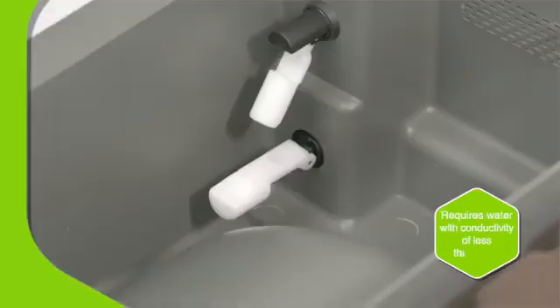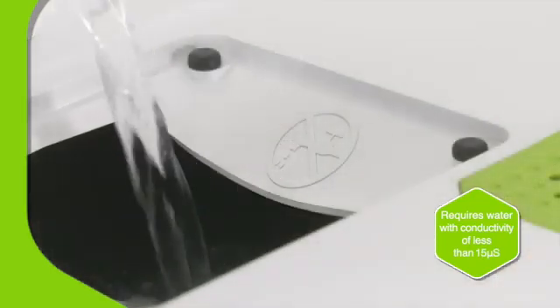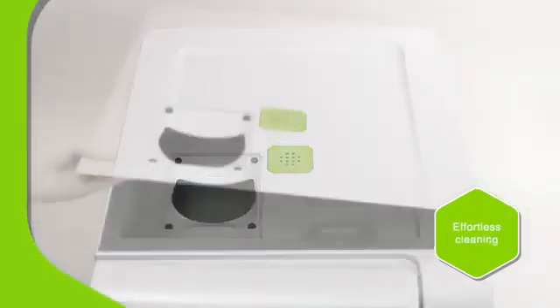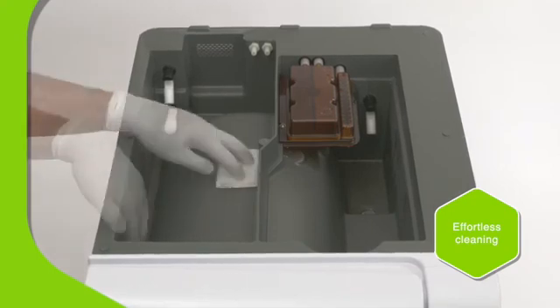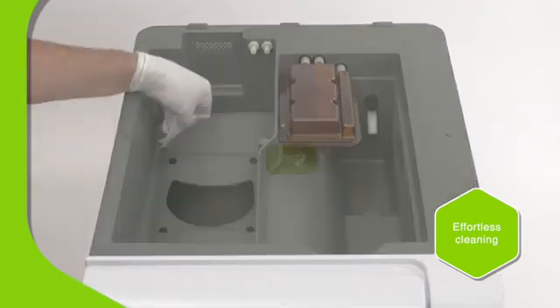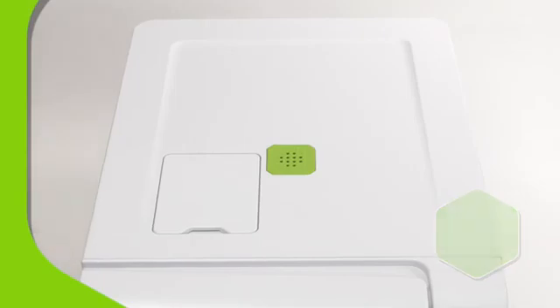The built-in air gap prevents the backflow of fluids to satisfy legal requirements. A built-in water quality sensor ensures the correct water is used, extending the service life of internal components. The water tanks are easily accessible for cleaning, without the use of tools — just another example of the high quality, user-centered design. No detail too small.